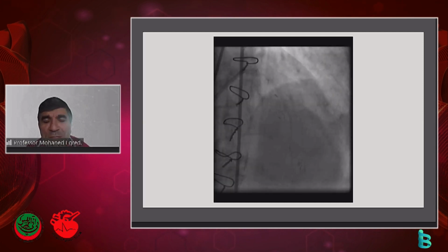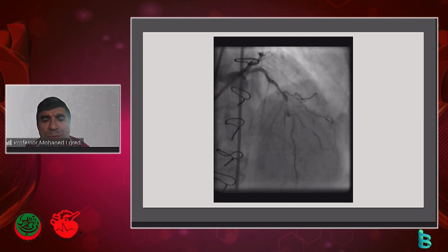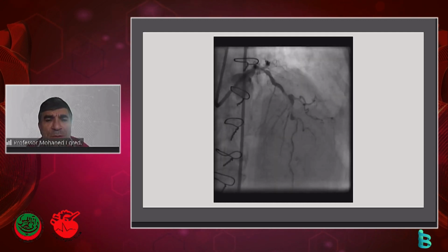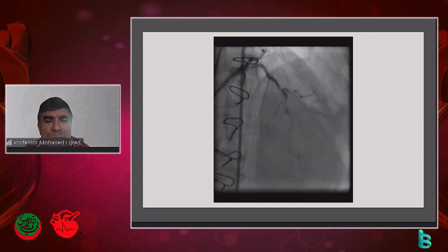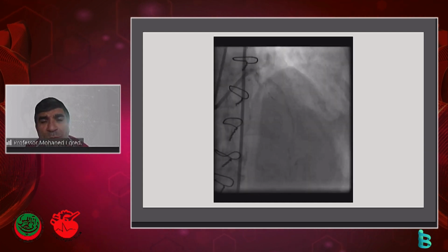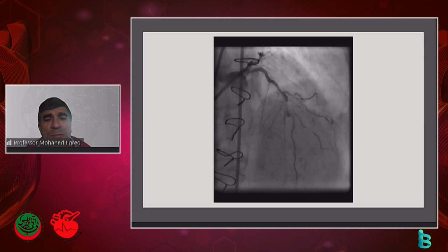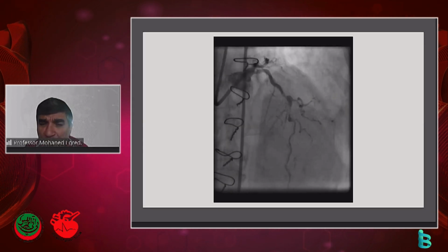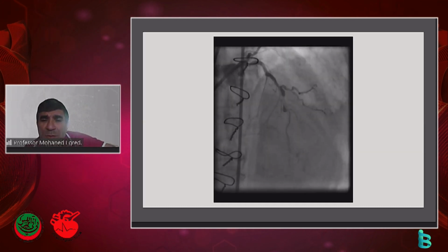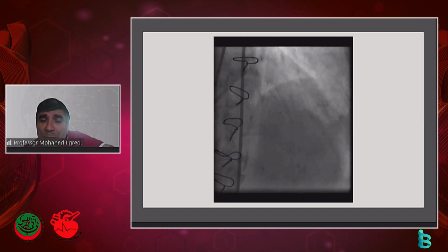Yeah, that's absolutely correct. When you look at this, heavily calcified, I don't think you could do it just with balloon and stent. That's for sure, which is quite typical after any bypass operation. Depending on the experience with rotablation, yes, severe angulation can be very troublesome with rotablation, because you could easily perforate. It's not out of the question, depending on your level of comfort and experience. Orbital atherectomy here can be really effective.